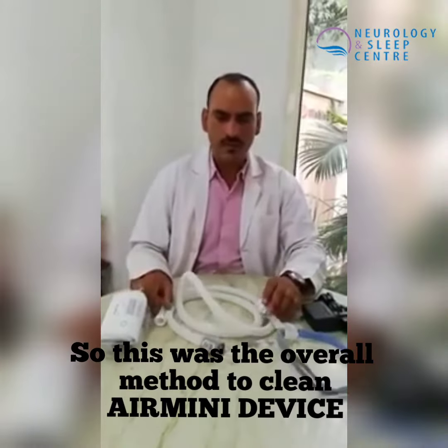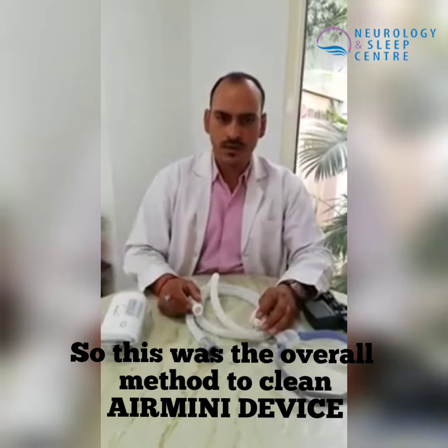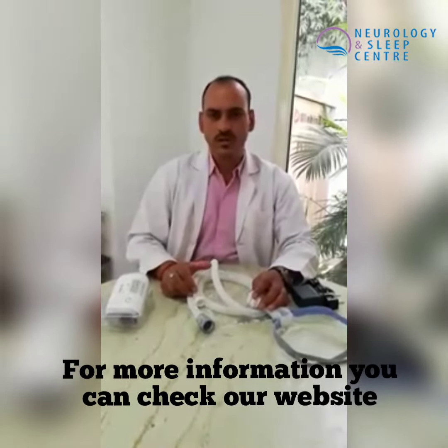This completes our Air Mini device cleaning and maintenance guide. For more information, please visit our website at www.neurology-sleepcenter.com. You can log in and see all your information. Thank you so much.